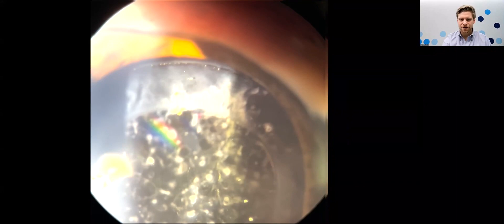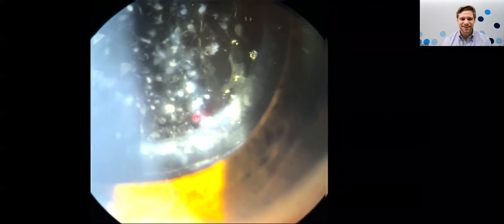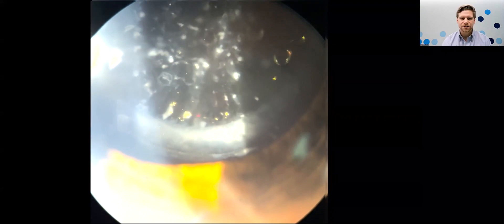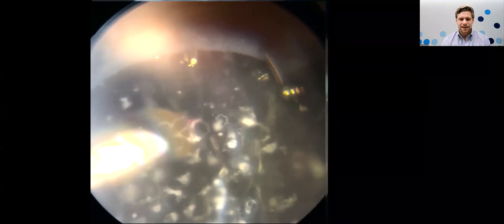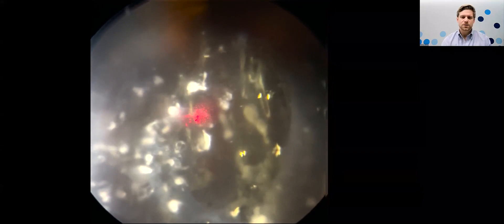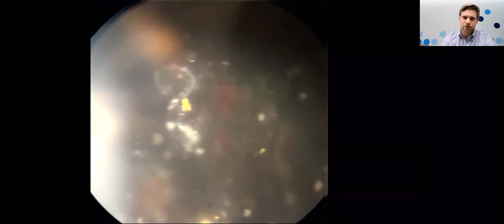This is a different laser — a red aiming beam as opposed to the green. I call this a salt-and-pepper anterior capsular membrane. Same idea: zero out my offset, use low energy. I like to start in the periphery because if you do get some lens pits, at least they're peripheral. Lens pits can really ruin a lens, so take your time when going more central. Be cautious of where you're aiming — I have had to do IOL exchanges on patients referred to me for severe glare and halos after a YAG capsulotomy.